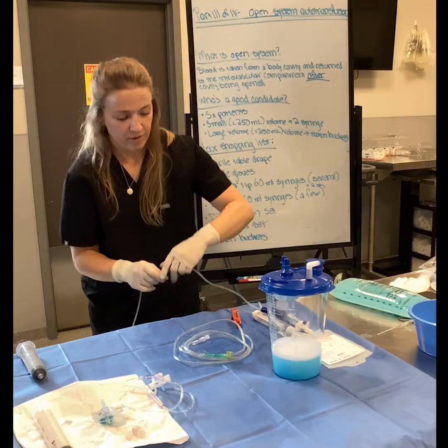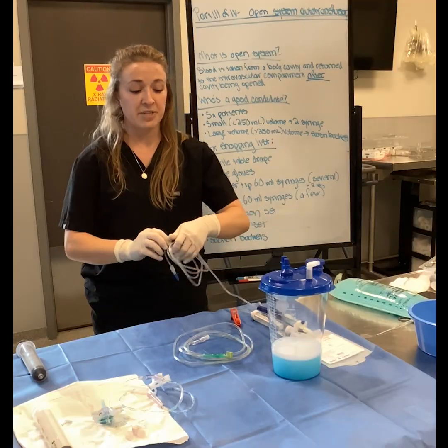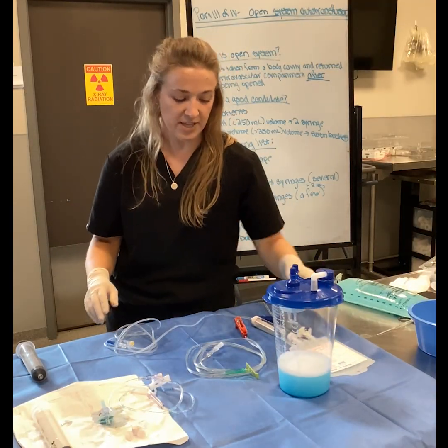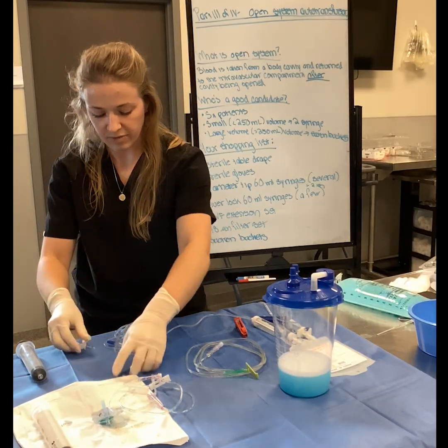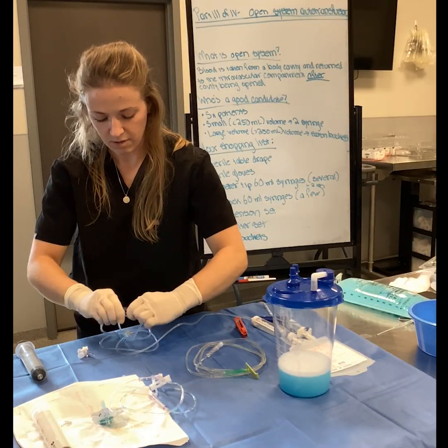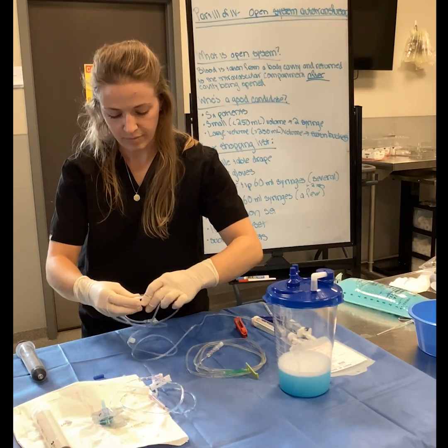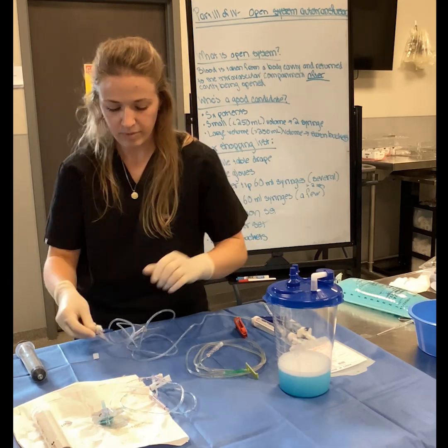So the most that I've ever done with a suction bucket was 5.5 liters. It did take a long time, but that patient did survive. So I think, at least in that situation, it was what we wanted. Okay, so let's get this on here. Perfect.